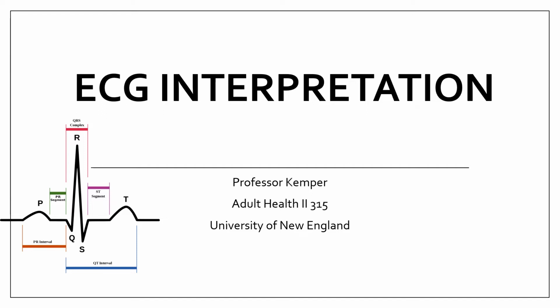Surprise. So, welcome. We're going to be talking about ECG interpretation today, and for many of you, this is an exciting subject, and for others, they don't love it that much because you know what? Over a period of time, you're going to start to understand this. Initially, it's going to be difficult. I'm not going to lie, but stick with me, okay? We're going to go over it today and then we're going to go over it again in class. So if you have questions, write them down. We'll talk about it in class together.